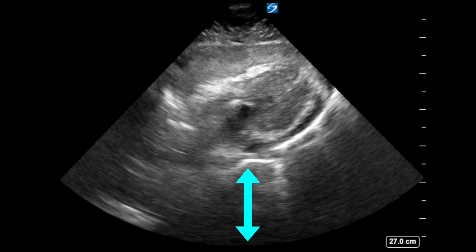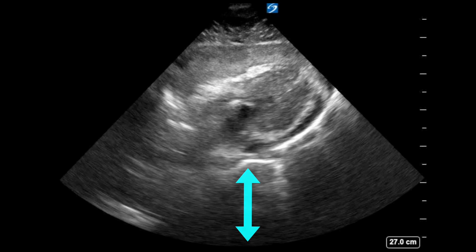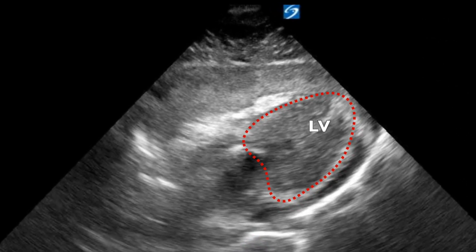One of the first things I'll say is that in this image there's a lot of wasted space — the depth is really deep, and this might have made it difficult to interpret the images. I would really encourage you to decrease that depth so you only see the pericardial sac when doing a cardiac ultrasound. In a code especially, that may help you to better interpret what's going on. I'm going to zoom in to about the depth I'd want to be, and we're going to see the left ventricle right here.